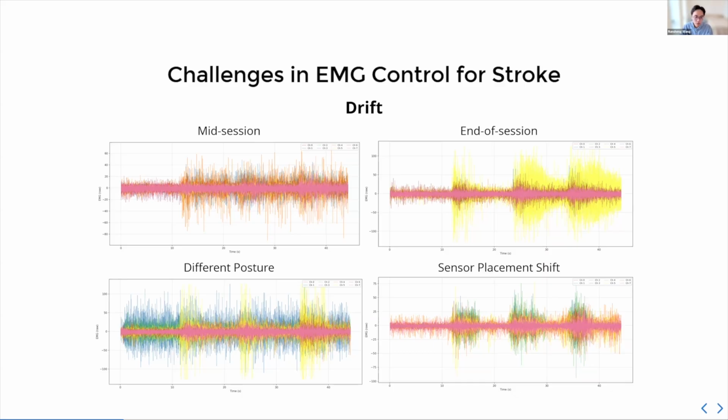The best way for me to show you this is to show you some sensor plots. This is the same sequence as before, where the person is going from relax to open and then back to relax a few times. And as you can see, even visually, if you compare the signals collected mid-session to the end of the session to a different posture, they're quite different. So classical methods such as thresholding or some frequency analysis will not work here. We're really trying to lean towards the more learning aspect of things.